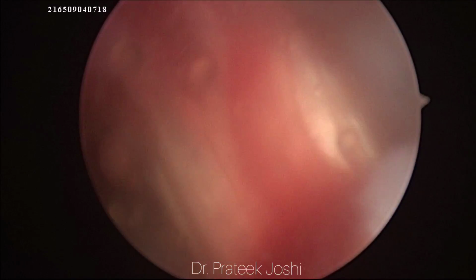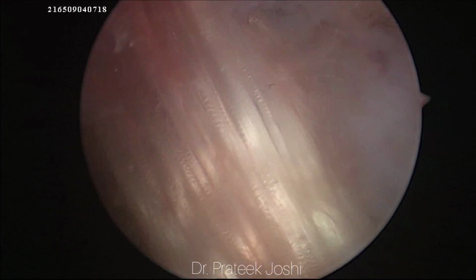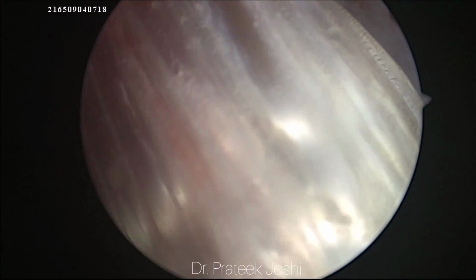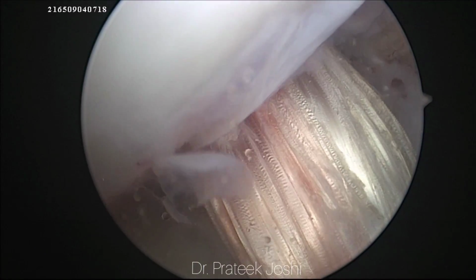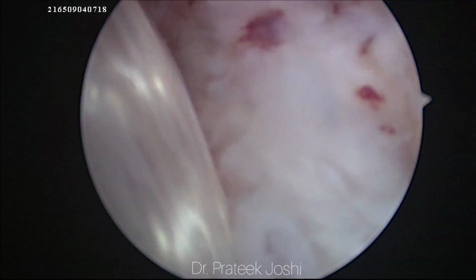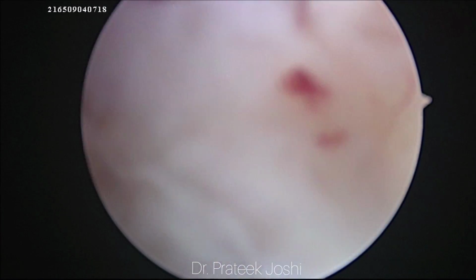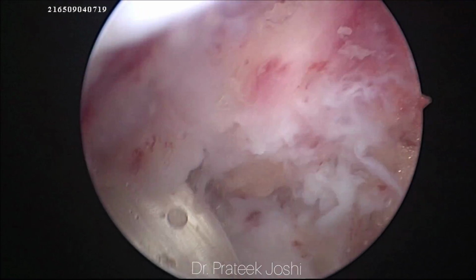So you can clearly see the continuous loop attached to the endobutton and the graft attached to the continuous loop, and now we are pulling our graft inside the femoral tunnel, and once we cross the mark of 18 mm of graft inside the femoral tunnel, we are going to flip our button by pulling the flipping thread attached to the endobutton. This is going to flip our endobutton over the lateral femoral cortex, and once it's flipped, we won't be able to pull the graft back down inside the tibial tunnel and outside of the knee joint.